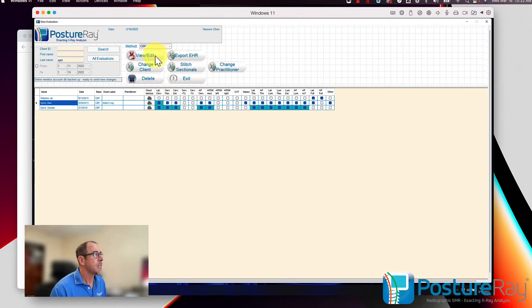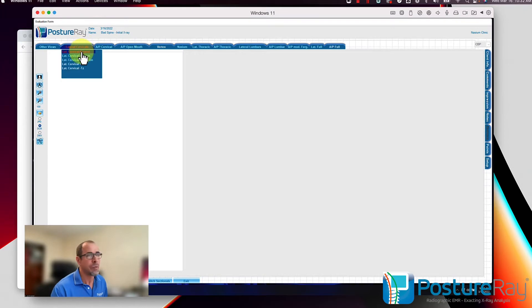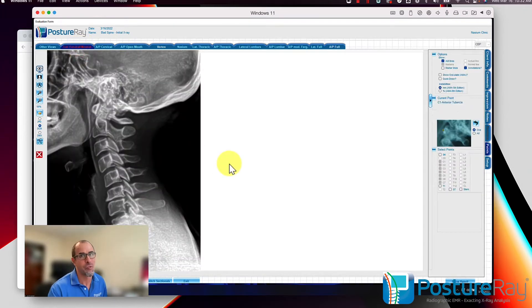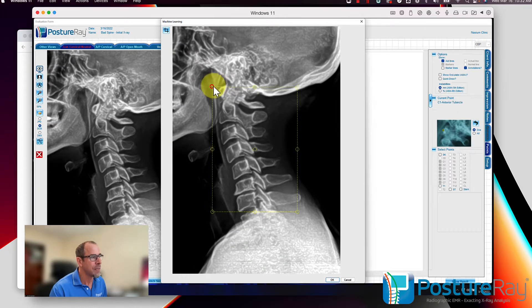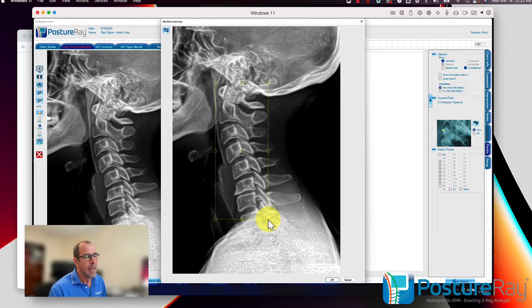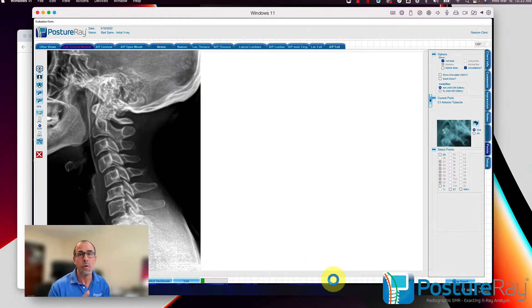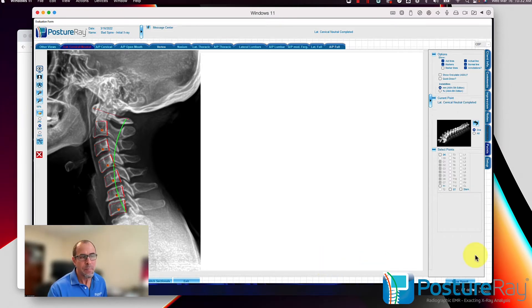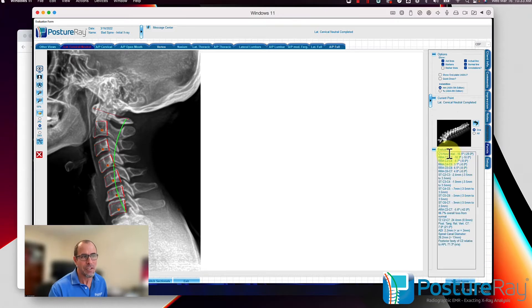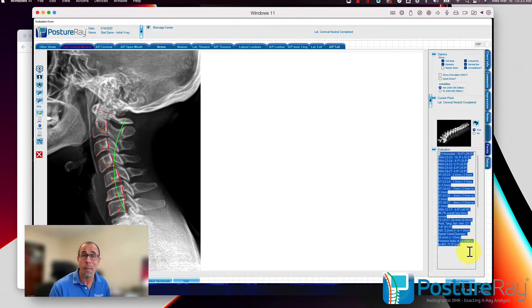I'm going to go ahead and view and edit, going into the lateral cervical neutral. Here's what is truly awesome — nobody else in the industry can even come close to doing something like this. What you and your staff can do is box in between C1 and T1, then load the other X-rays. The lateral cervical flexion and extension X-rays have computer vision already enabled. The system automatically analyzes the X-rays to find all the rotations and translations — those are literally the measurements.